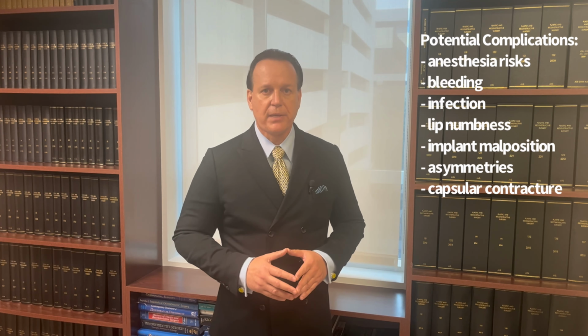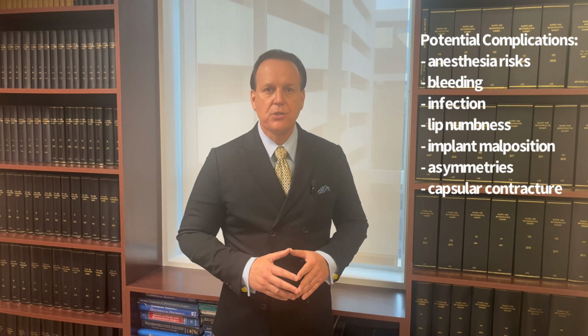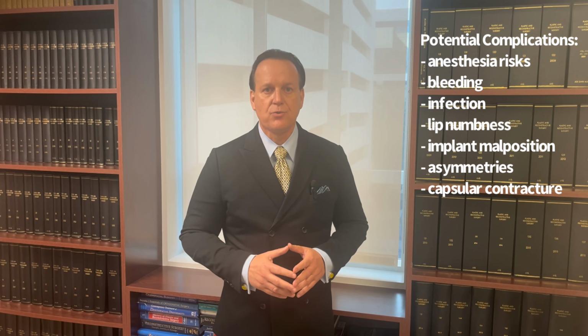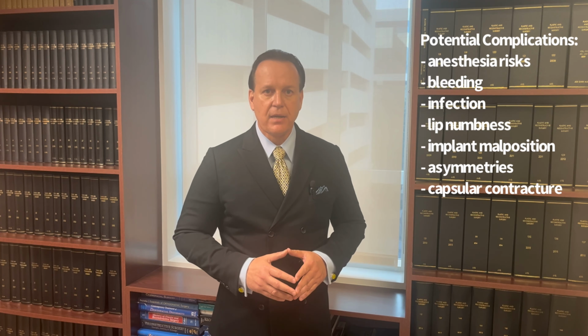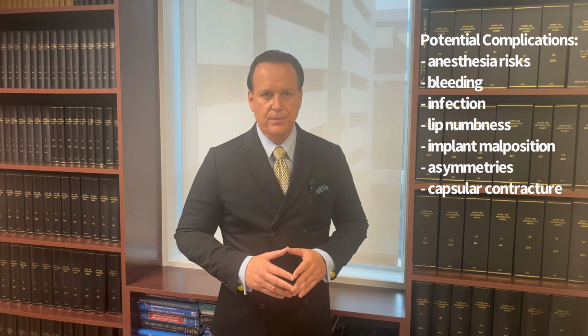Another potential complication is implant displacement. This is more of a concern for patients who are involved in high-contact sports or activities that could lead to trauma to the face. However, this risk can often be mitigated by avoiding such activities during the initial recovery phase.